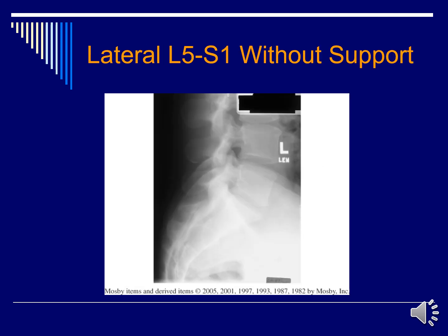This next image here does not have the support. And if you look at the intervertebral foramen, you see that there are two problems here. First of all, I see the pedicles are not superimposed, so there was a sag on the patient's back. I can tell that because I do not see the blocks in the body. It should be one block or one marshmallow without being able to see both sides or both rims of the body. And I should see the pedicles stacked directly on top of each other where I cannot tell one from the other. So that is sag.